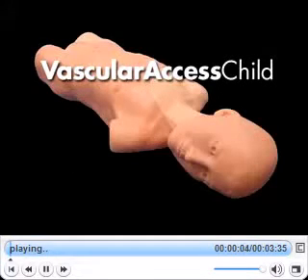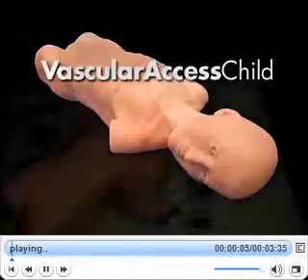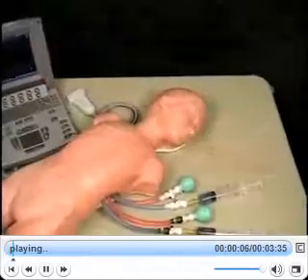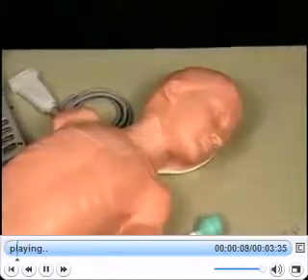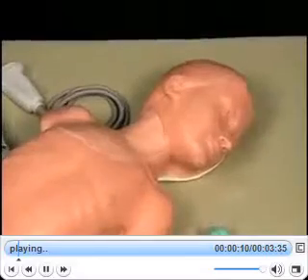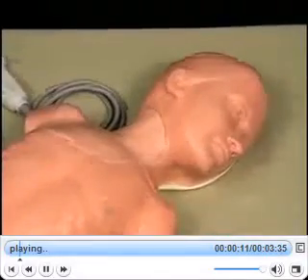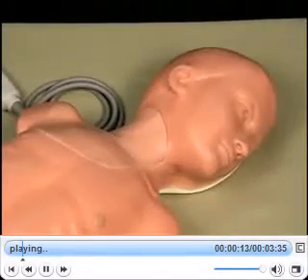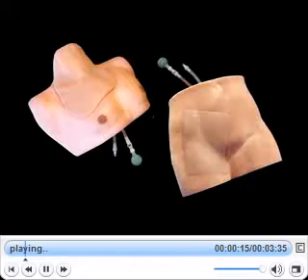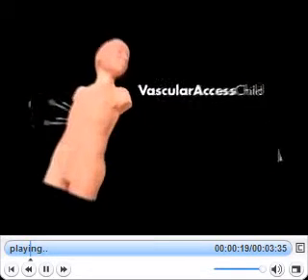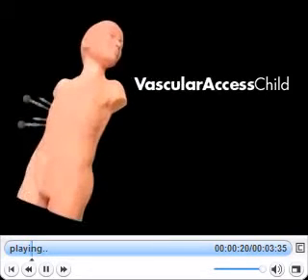Vascular Access Child is a high-fidelity central venous access training solution specifically designed for pediatric training. Simulab designed this simulator by leveraging its highly acclaimed adult-sized simulators, central line man and femoral line man, and then customizing it to meet the unique needs of pediatric vascular catheterization.